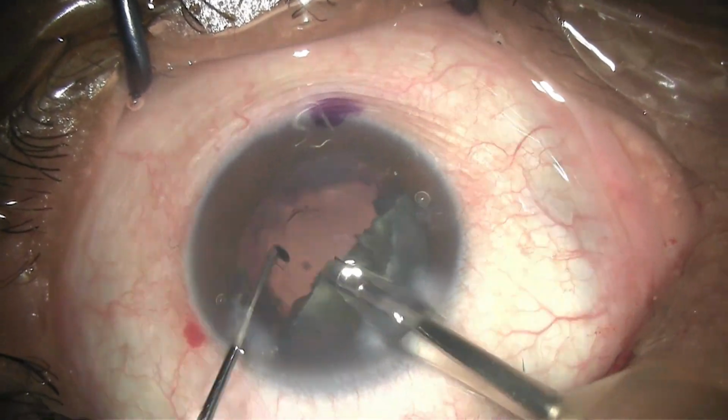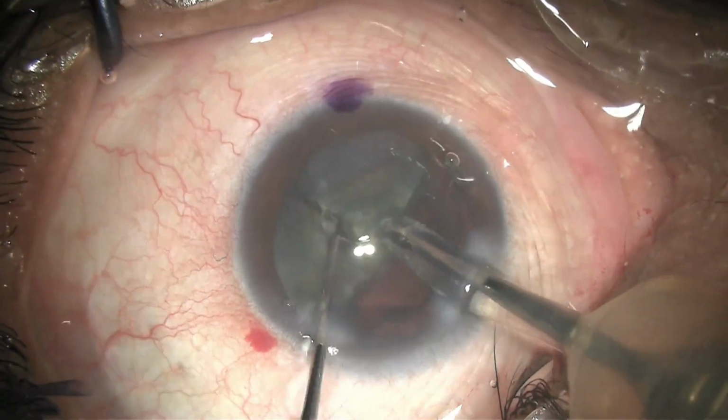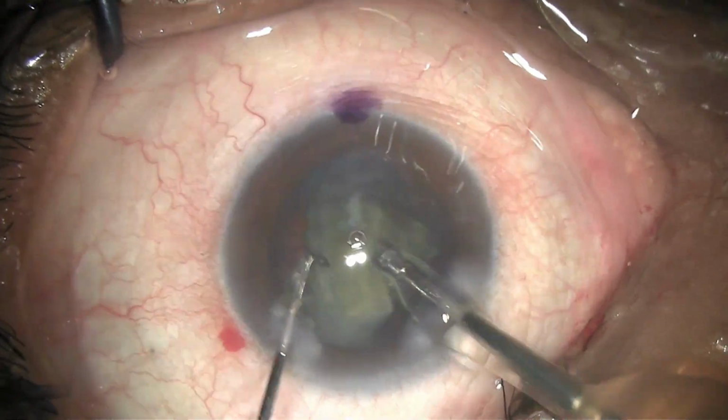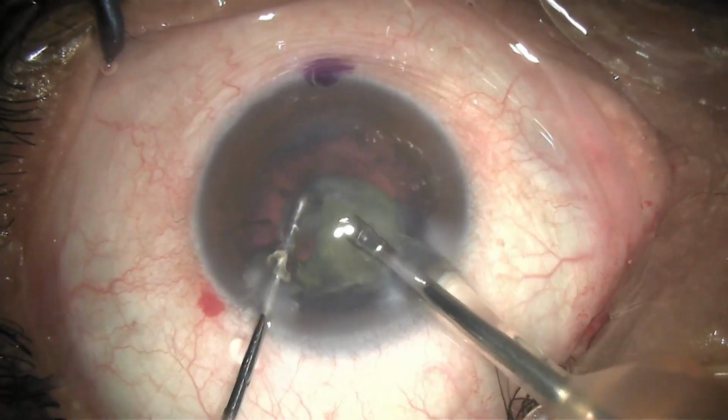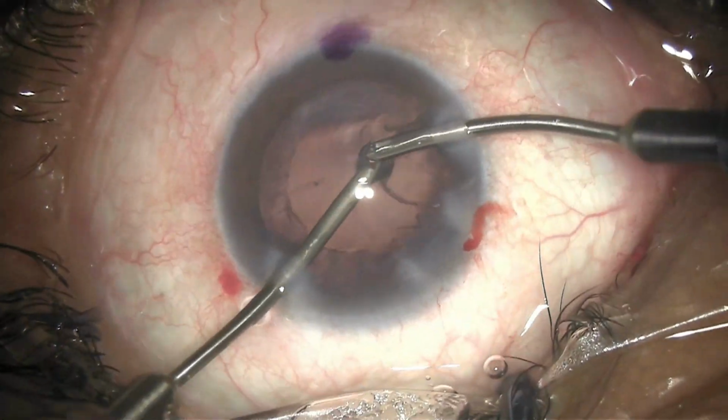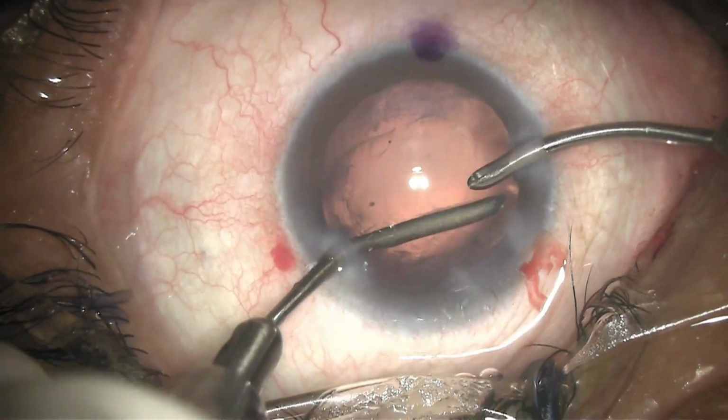So that is half the cataract out, and the rest of the phacoemulsification goes on uneventfully. The cortical cleanup is done by the bimanual irrigation aspiration system.